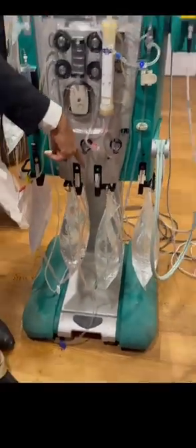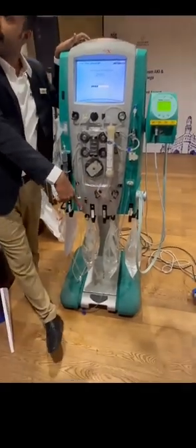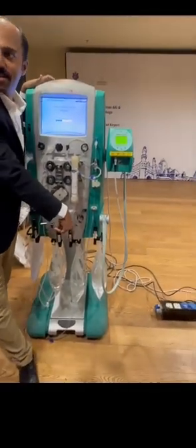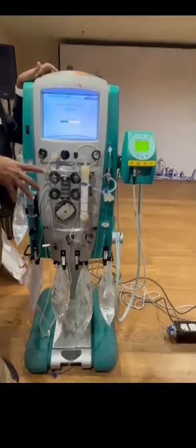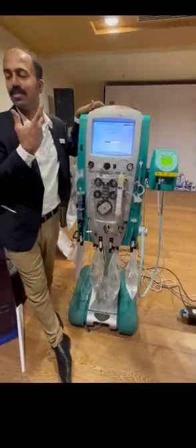If I am adding 5 ml, the concentration will be 2 milliequivalent. If I am adding 7.5 ml, the concentration will be 3. If I am adding 10 ml, that is 1 ampule, that will become 4 milliequivalent. So as usual, we can add 4.